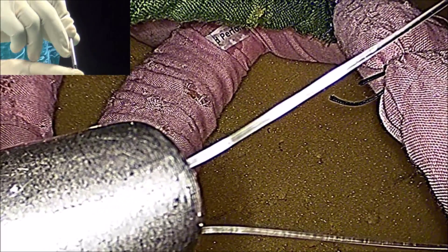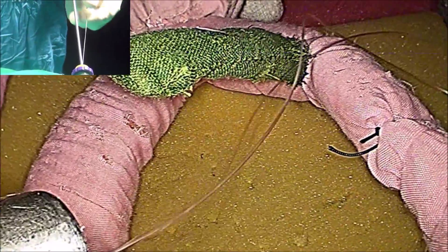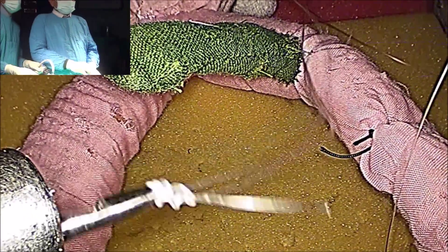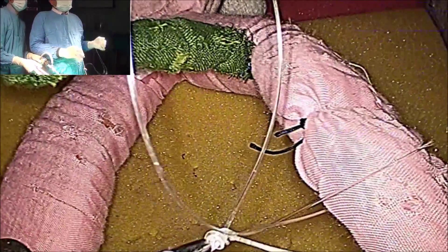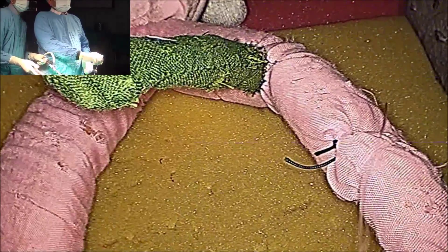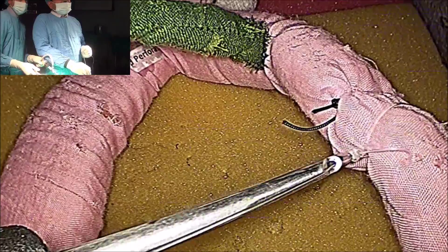Now hide it with the reducer and go in. And here is the knot — it is a beautiful knot. Now pull it and decide where you want the knot. You can adjust it according to your wish. Then keep the tip of the knot pusher and tighten it.